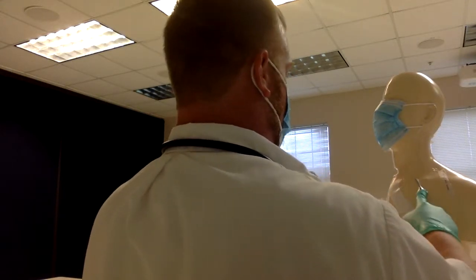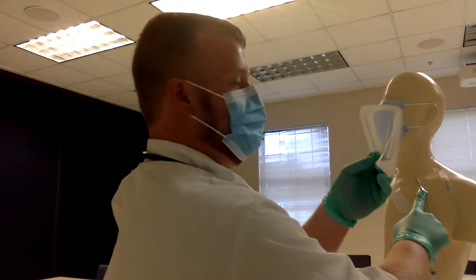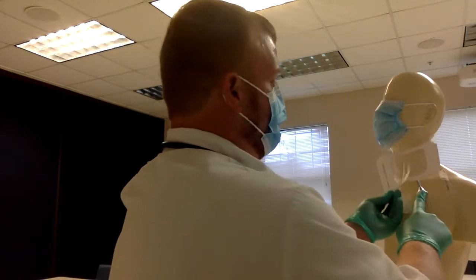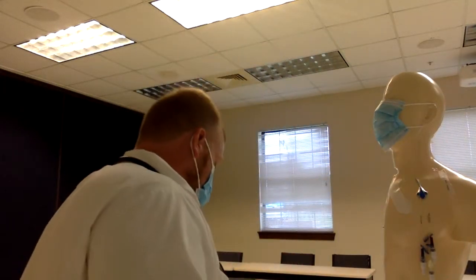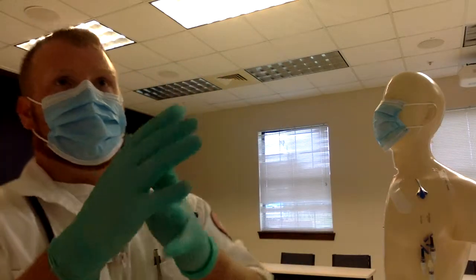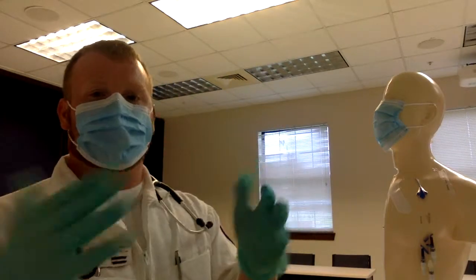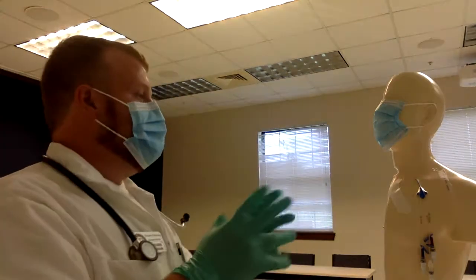Now we're going to stick this directly on here. I'm not going to stick it on the mannequin because I don't want to mess it up. We stick it directly on and seal it, making sure there aren't any creases for things to travel through. We want it really flat and flush all around, all the edges.